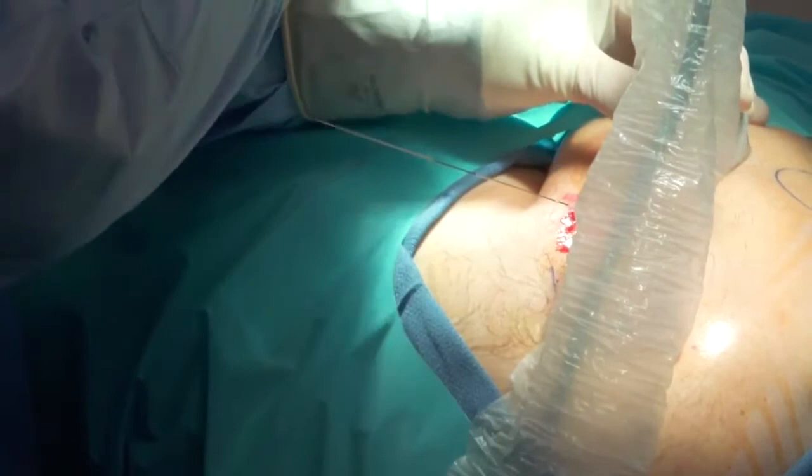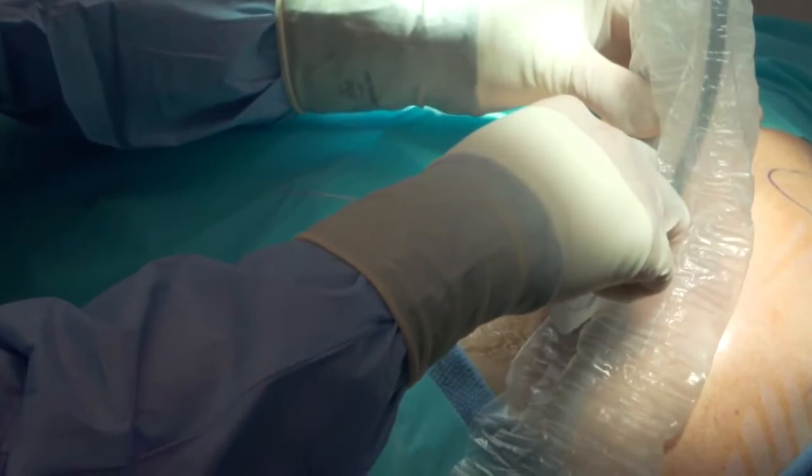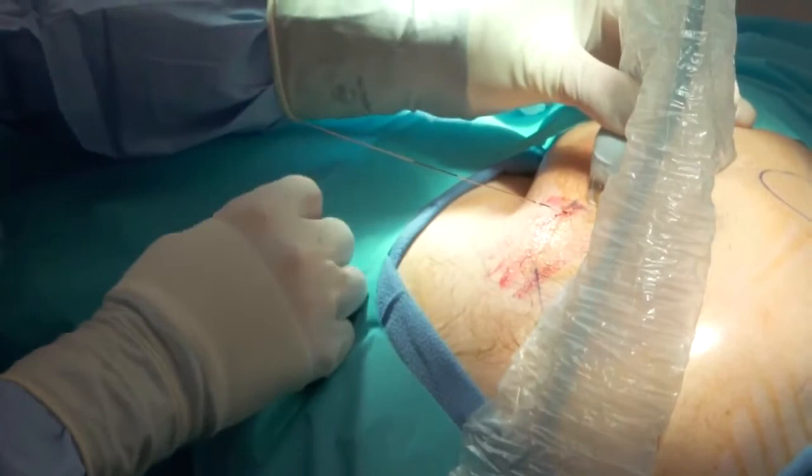So I'm going to ask Colleen now to give me the stimulator, and we're going to try to stimulate. Yep. We're going to grab one of those yellow cords. White is sterile. And the yellow goes to me.